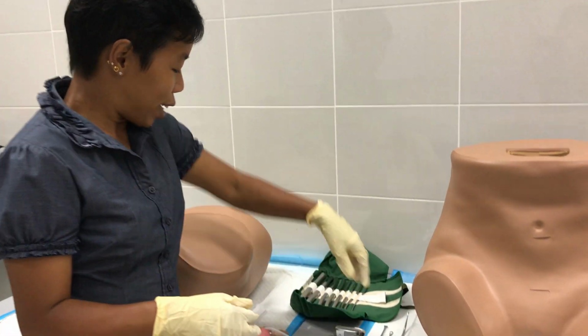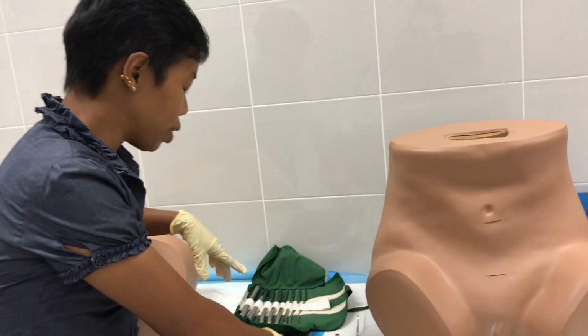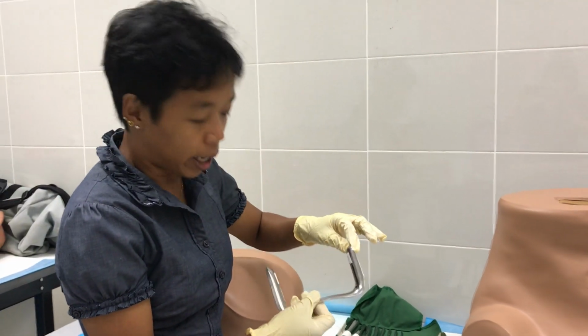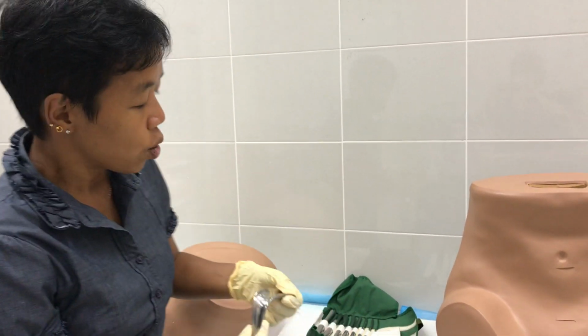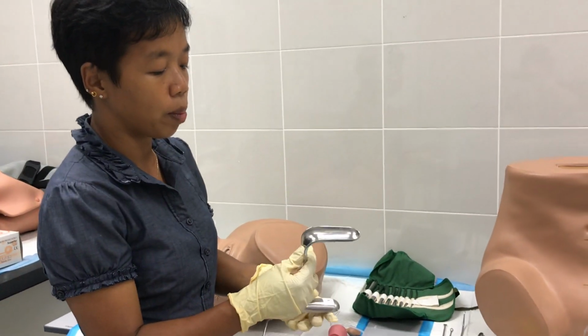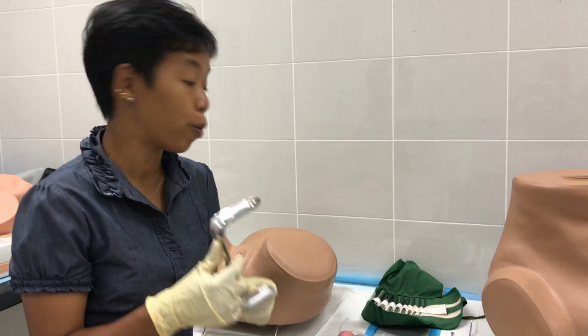Alright, today I'm going to show how to do the dilatation and curettage in the operation theatre. So what instruments do you need? This is the Sims speculum, the one we normally use for gynae procedures.